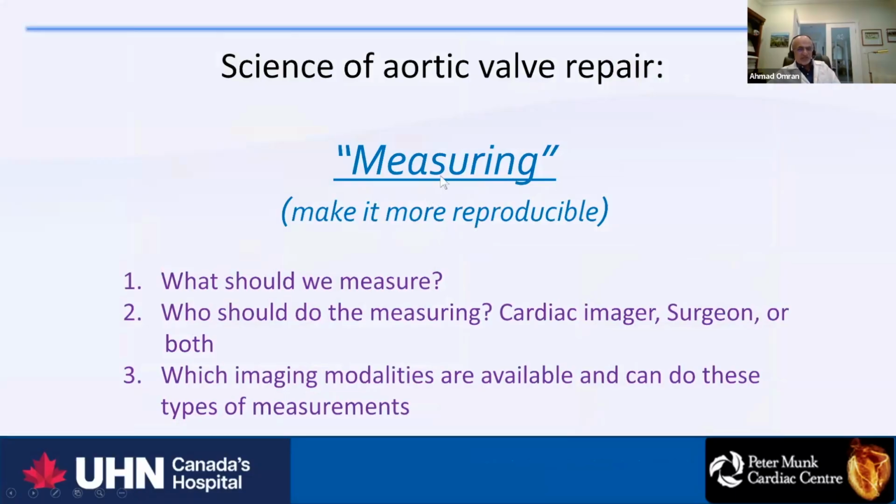We have to measure it. So what should we measure? We should measure everything that I showed you in the previous slide as the surgeon can do it. So I believe that all the measurements that the surgeon needs to do before starting to repair the valve, the echocardiographer should be able to do. And now we have the software to do it.